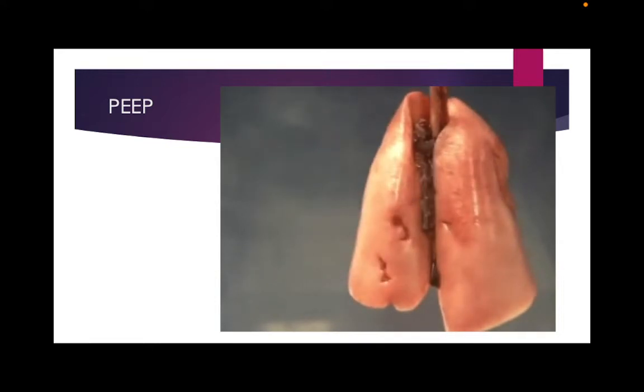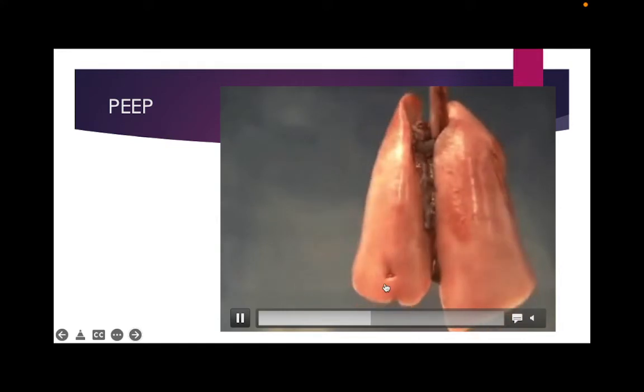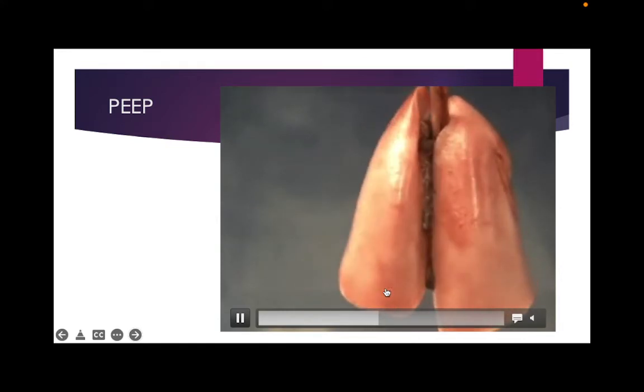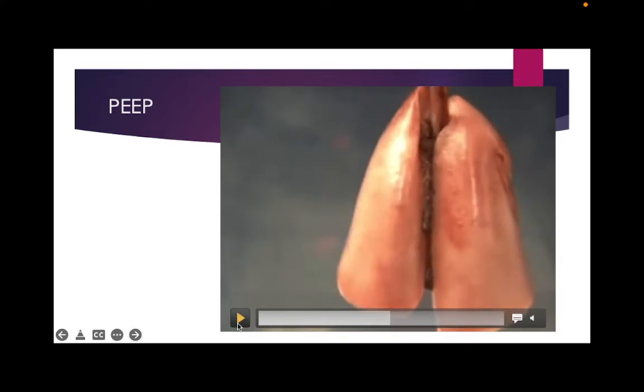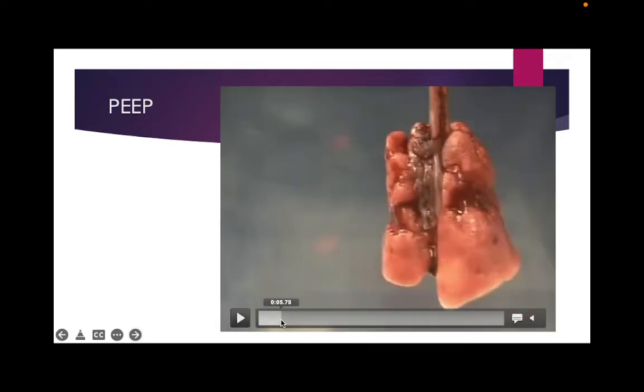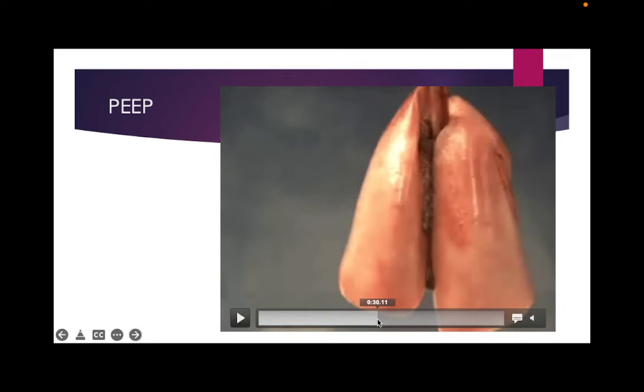They're being recruited. They're opening up, right? We're almost there, almost all there. Wait for it. One more. Oh, right? So look how beautiful that lung looks, right? This lung is being used efficiently. All the areas are participating in gas exchange compared to over here. Look how sad and depressed that lung is, right? You have all these areas. Is any oxygen and CO2 exchange happening here? No. Those alveoli are useless, right?